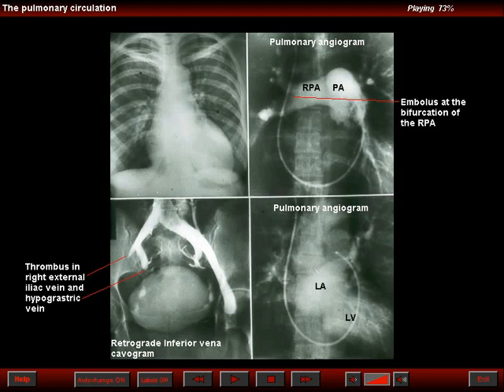When we finish our angiographic examination of the pulmonary circulation, we may drop the catheter to the level of the inferior vena cava and make a retrograde injection. If the cava is free of thrombi, we can advance the catheter to the bifurcation of the cava and do a retrograde injection. This is done when we suspect that the source of emboli may not come from the veins of the lower extremities.